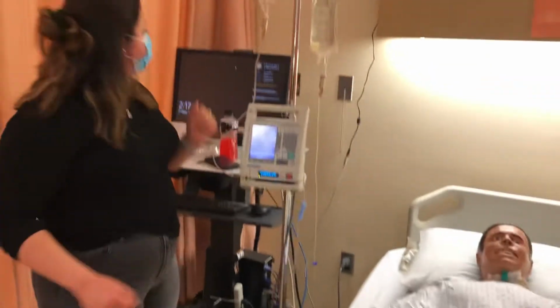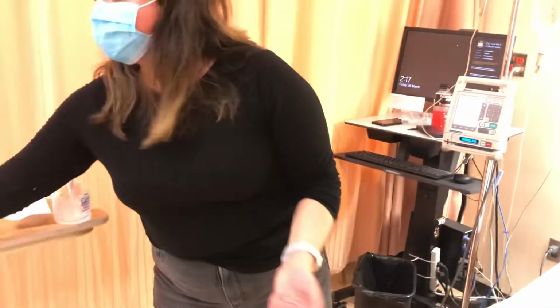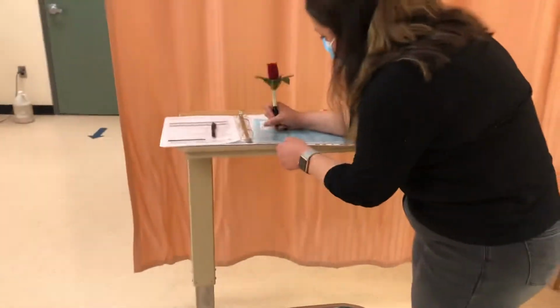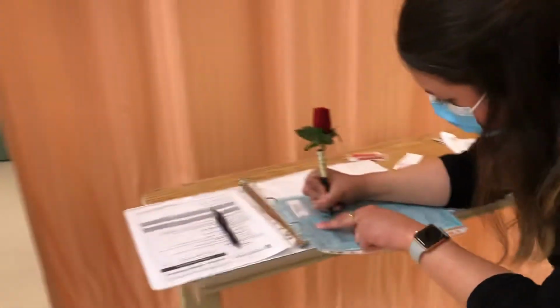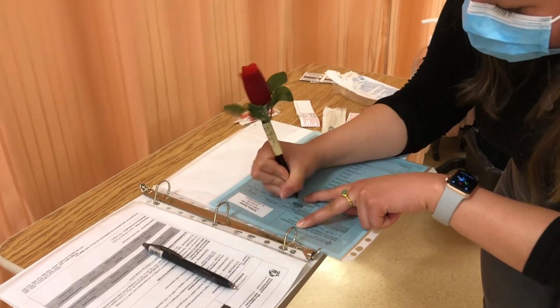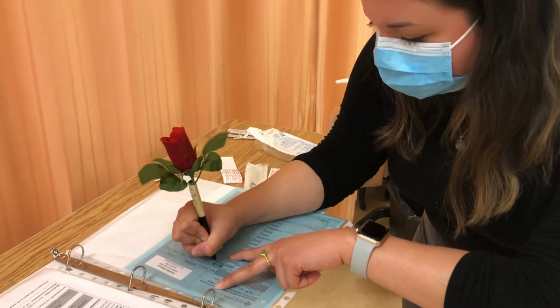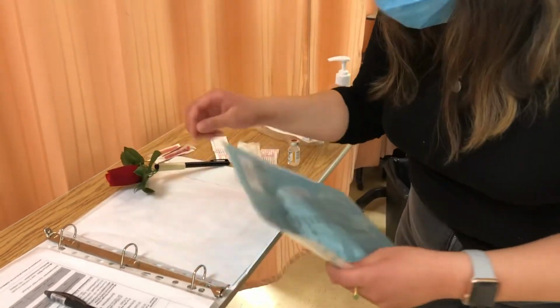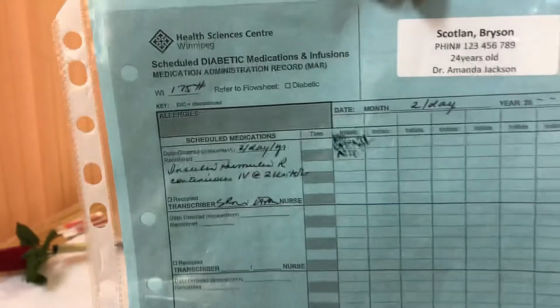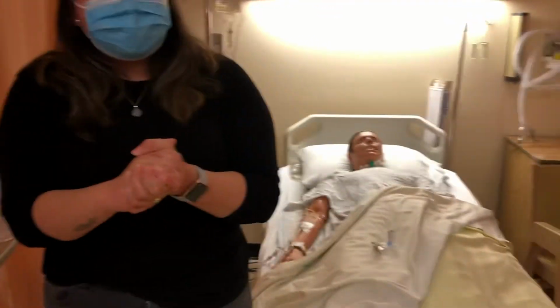Everything is running smoothly. For the purposes of this video, I would perform my exit safety check, and then I would sign my MAR. I would close this and lock it properly, and then press start. So on my MAR, I would sign my name, flash, green light, my initials, my designation. My second nurse would also sign the MAR, and I would say at what time I started the infusion. This is an awful pen. I am very sorry. Patient has the PCA button within reach, and they're aware. And it is complete.